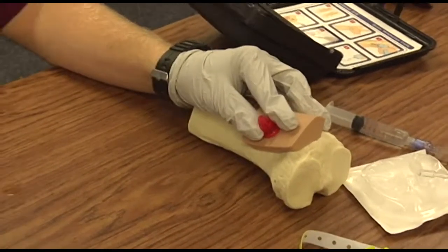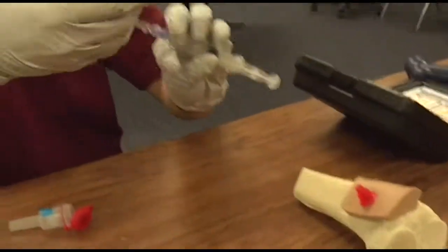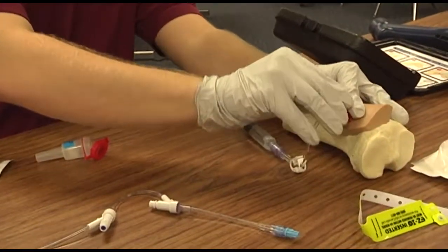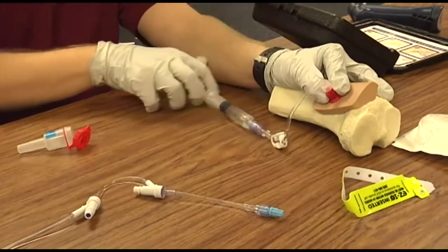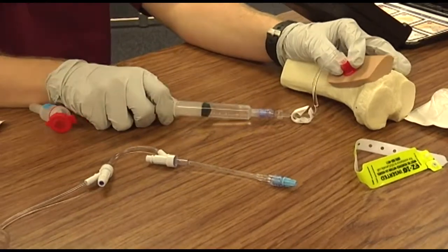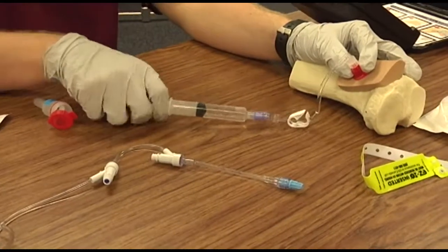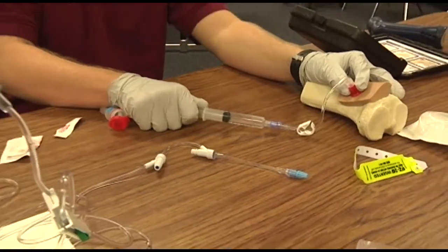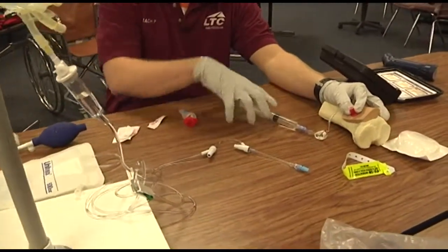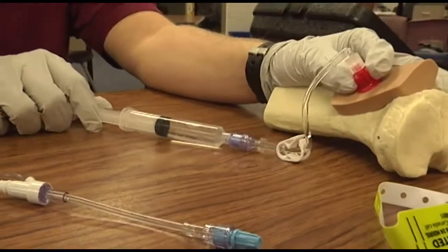Attaches the extension set to the luer lock connection. Assures placement by any two of the following: catheter is firmly seated, notices blood in the catheter hub, able to aspirate blood or marrow — so you can try to aspirate — or no signs of extravasation with fluid administration. This is when you could push fluid, assuming placement is confirmed.